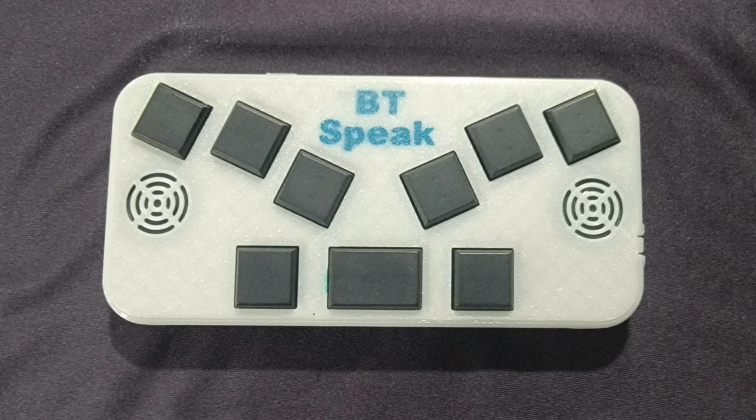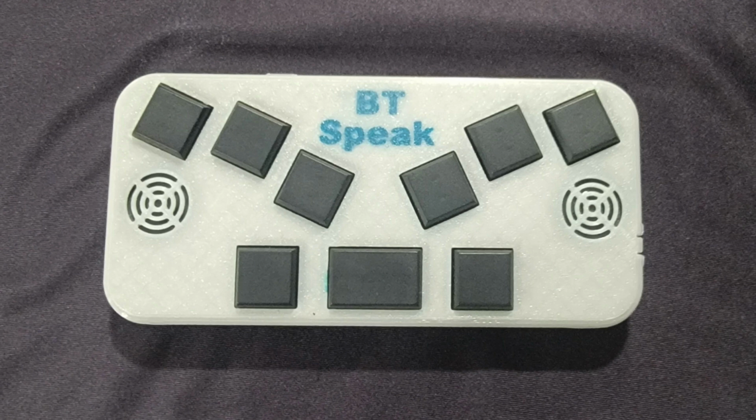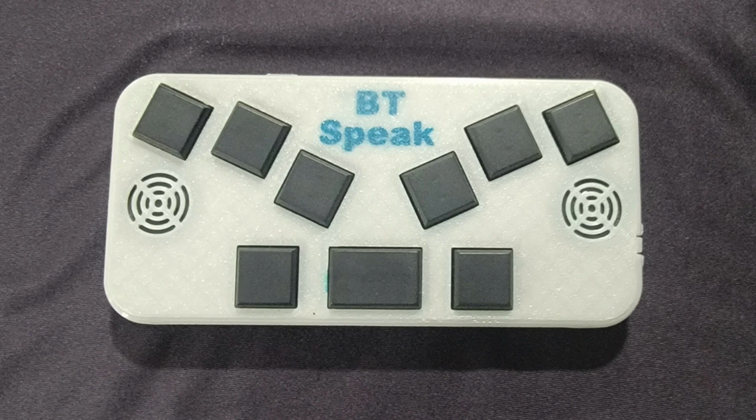I am testing the BT Speak and going to send this text to my iPhone. Let's see if that was accurate. I am testing the BT Speak and going to send this text to my iPhone. Yes, it was accurate. I'm typing with this on my lap, and sometimes I don't have my hands positioned correctly, and I make a mistake or two, so I wanted to verify.